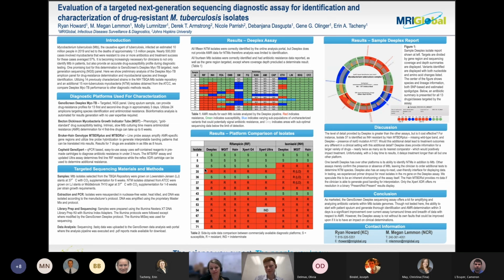But if you're looking for more specific information and you want a full panel of drugs and you have skilled technicians and time, a couple days, then this is definitely a lot more information, more bang for your buck, I guess. Although it is a lot of bucks, so there's that too.